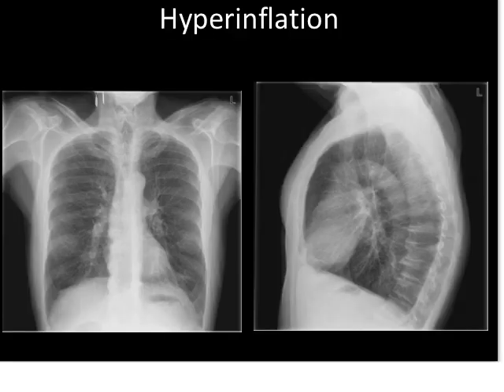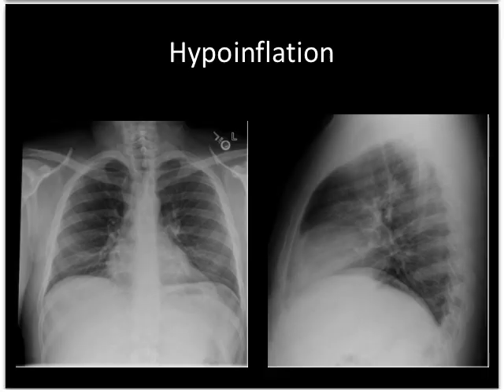Here's a patient who is hyperinflated. The diaphragms come down to approximately the eleventh rib posteriorly, but that, to be honest, is not as helpful as looking at the lateral study — you can see how flat these hemidiaphragms are; you can pretty much put a ruler along them. Conversely, this patient is hypoinflated. You can see that diaphragm coming up almost all the way to the level of the hilum on the lateral study, and the diaphragms come down to about the ninth posterior rib on the PA study.